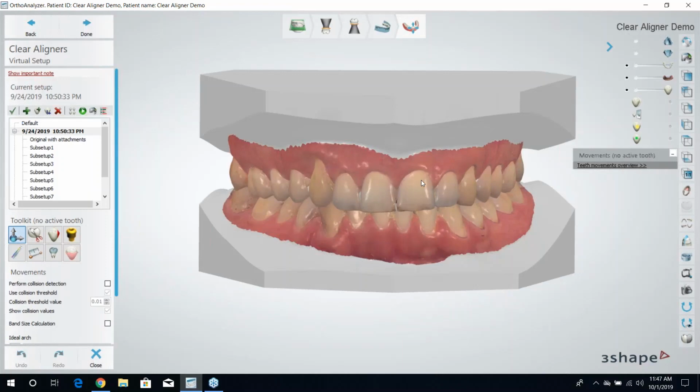They want something clear that can help revolutionize their smile. This is a really good option for that, and I think the Clear Aligner Studio is a really powerful tool that can enable you to do that. So that's all I've got.